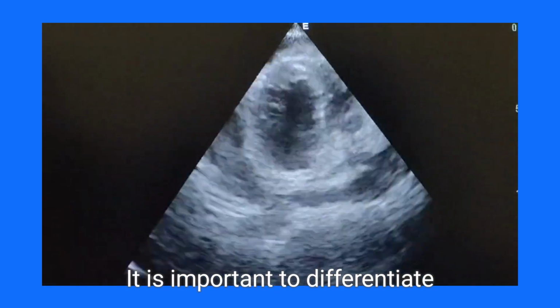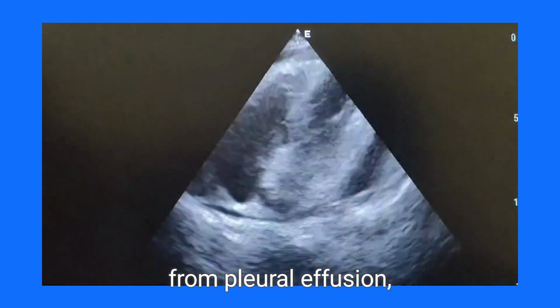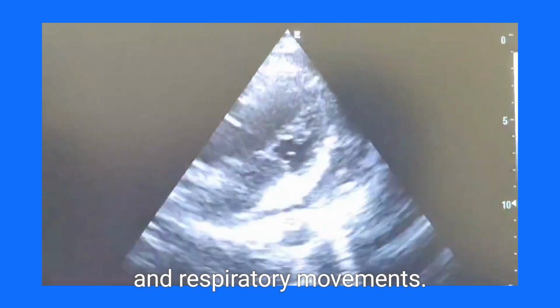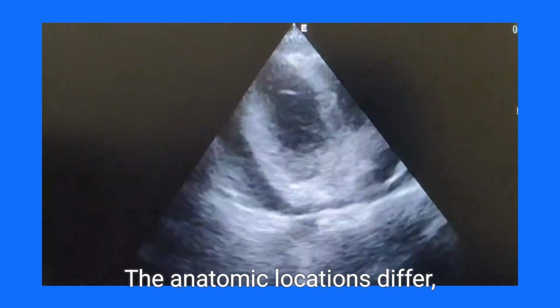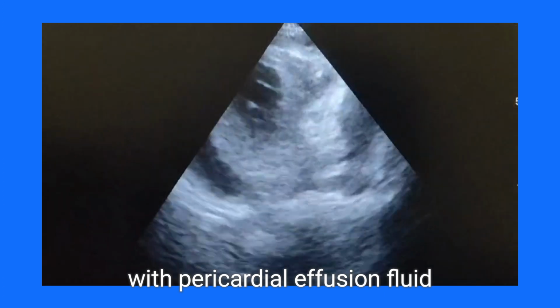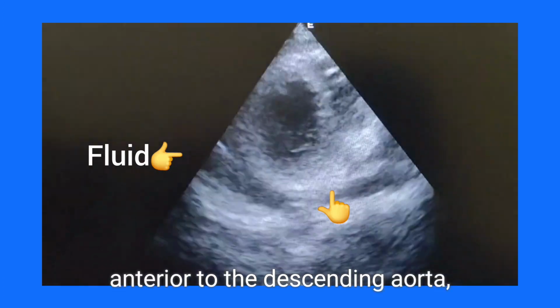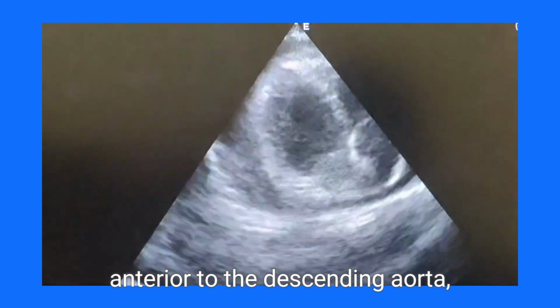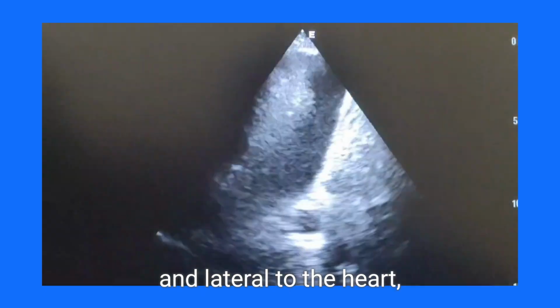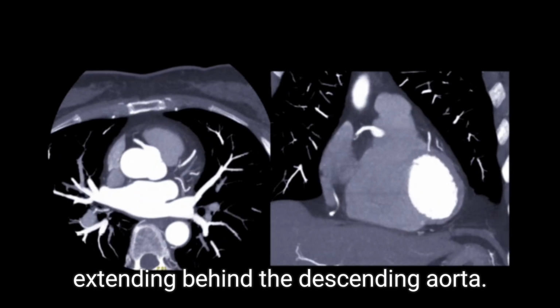It is important to differentiate pericardial effusion from pleural effusion, as they have different anatomical locations and respiratory movements. The anatomic locations differ, with pericardial effusion fluid confined within the pericardium, anterior to the descending aorta, while pleural effusion fluid is located posterior and lateral to the heart, extending behind the descending aorta.